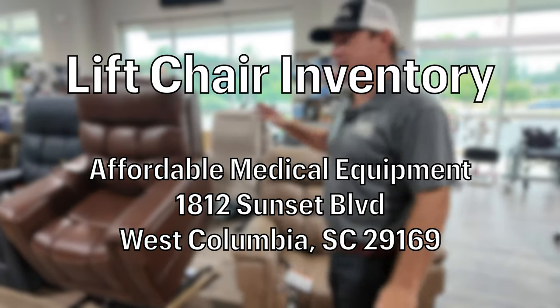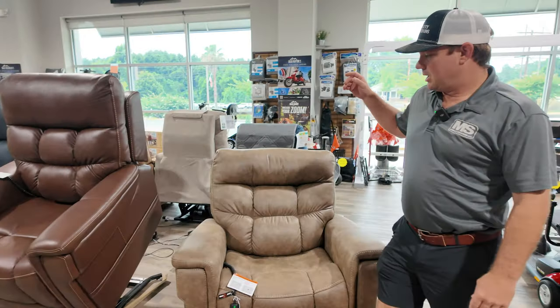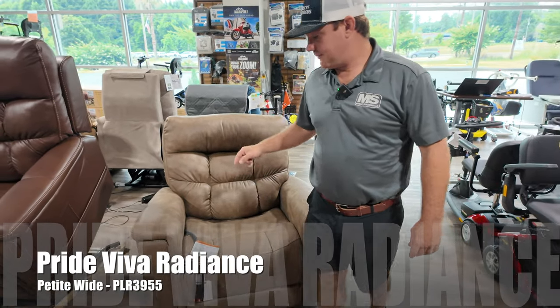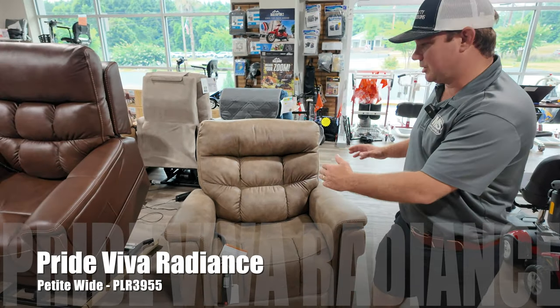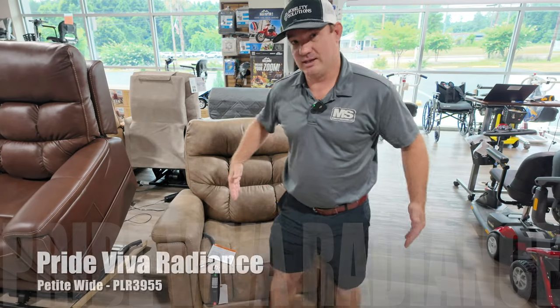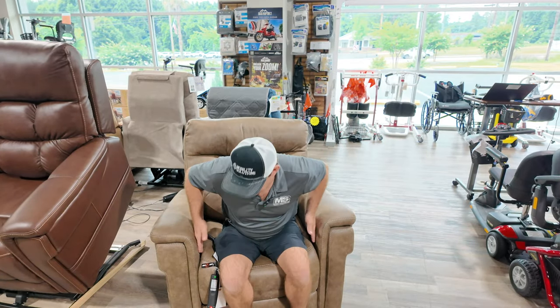Chairs change, new chairs come out. Still, this is a good chair. This is the Viva PLR 3955 in the petite wide. This is a great chair for someone that's short and needs a little bit of width between the arms.